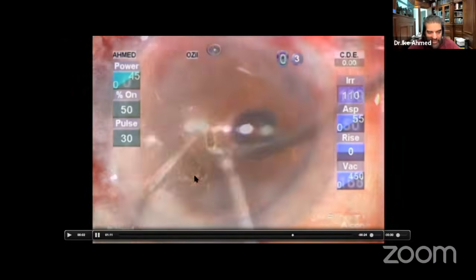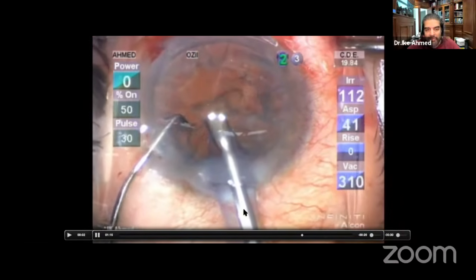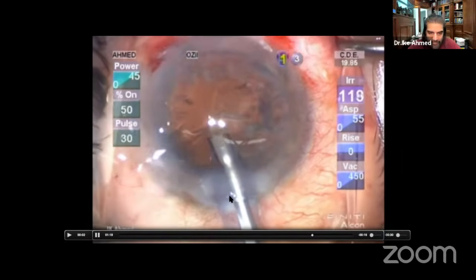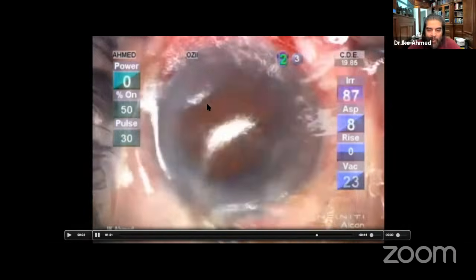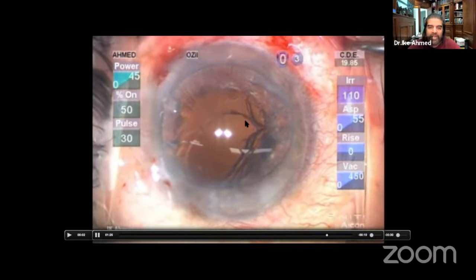You see where it's run out there. And the problem when we do this is that if we allow the chamber to shallow, in some cases, as you'll see here, look what happens in this case. Everything's intact so far, but watch very closely. And there the rexis is wrapped around into the posterior capsule.